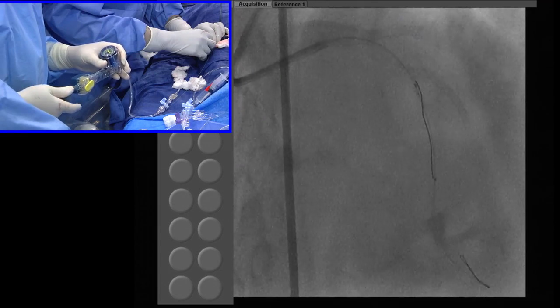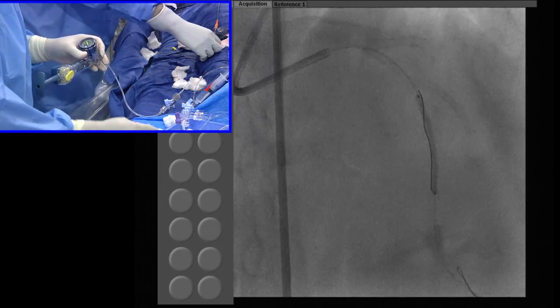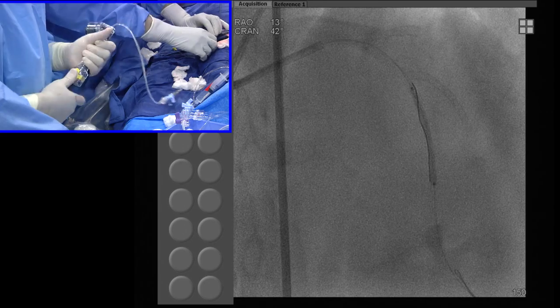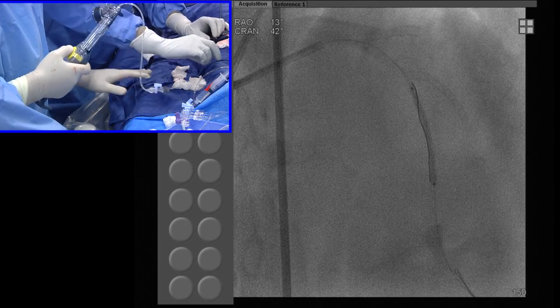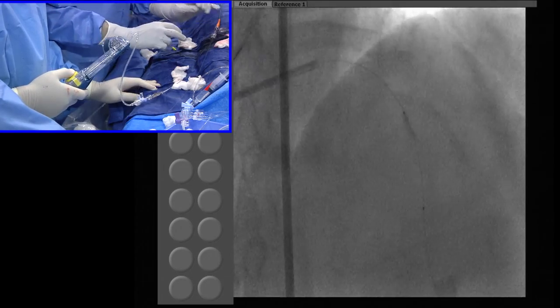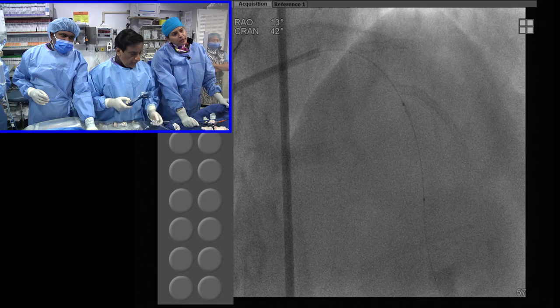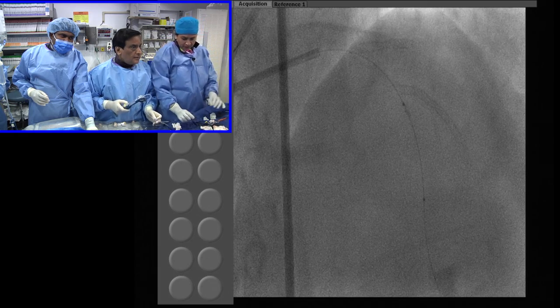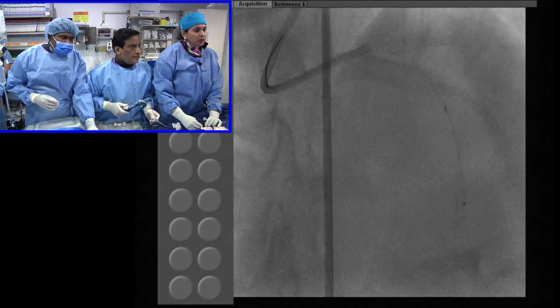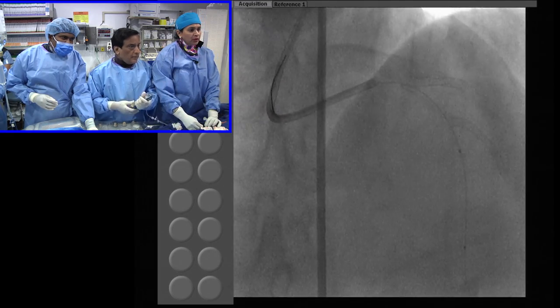So this is a 2.5 long balloon. We can take the 2.25 through wire balloon. But we need to go a little further. And the stent actually now could be a 2.5 or 2.25, 38? 30, 33 or 38. Go a little further. 32, 33. 32 now. A little bit more. No, you want to go a little distal. We don't have that long. No, this is the one.